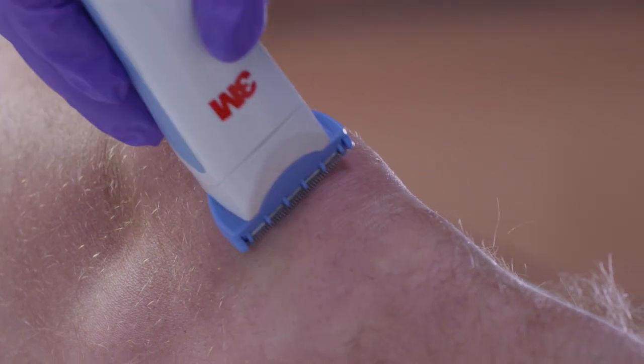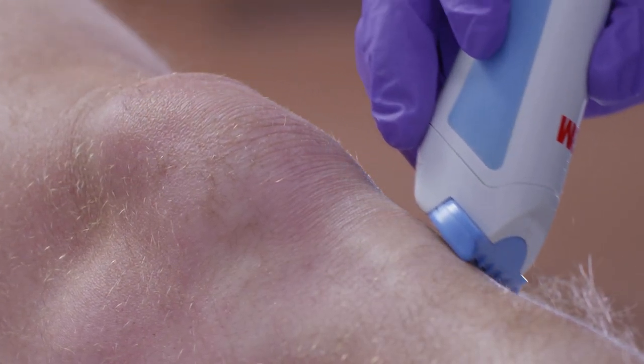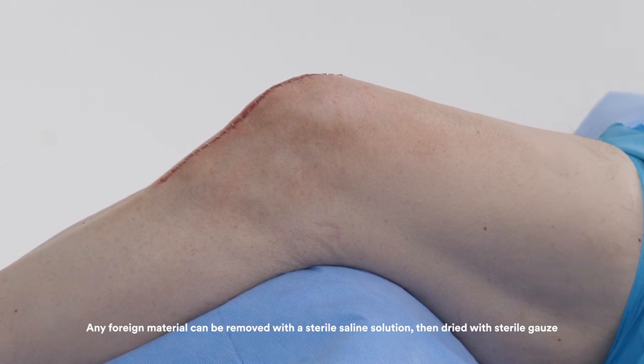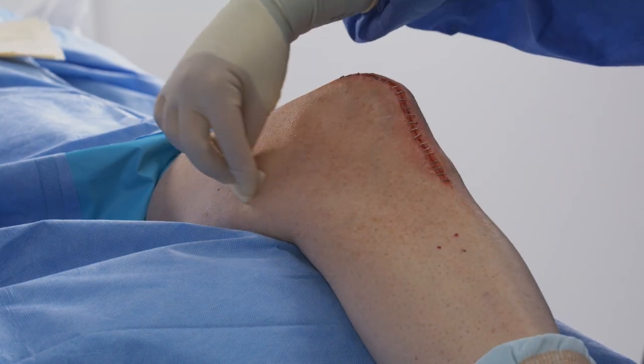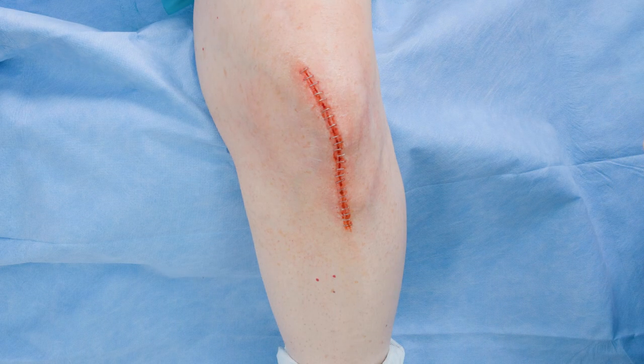You'll notice that the hair has been pre-operatively clipped to accommodate the area where the dressing will be applied. It's important that this area is clean and completely dry before application to ensure a tight seal. Once incision and peri-wound skin is clean and dry, apply 3M Cavilon no-sting barrier film to peri-wound skin to prepare the area.